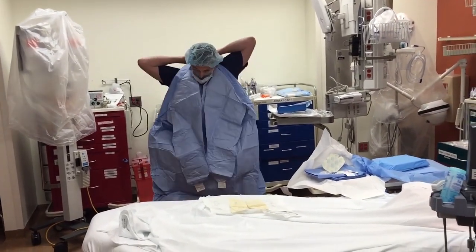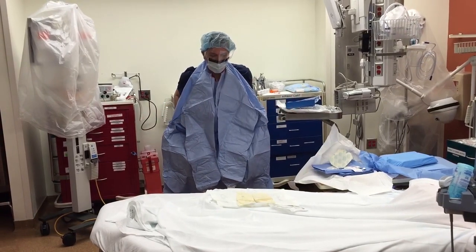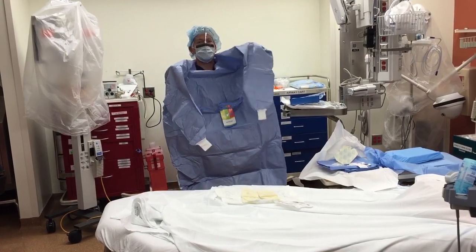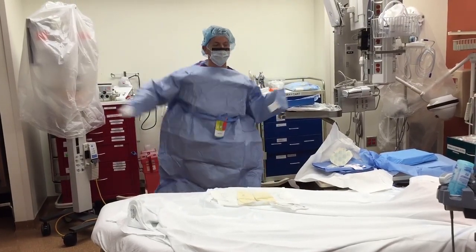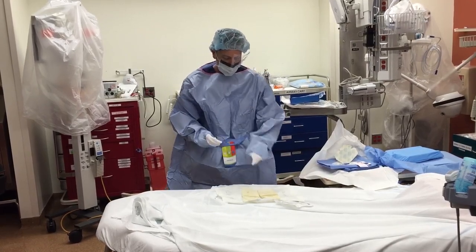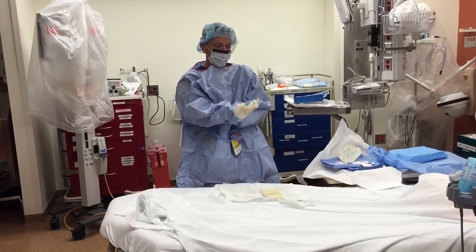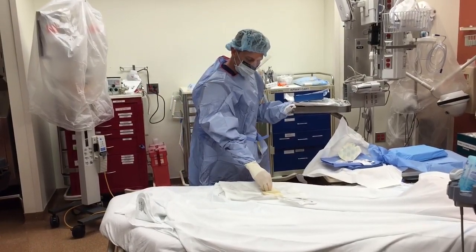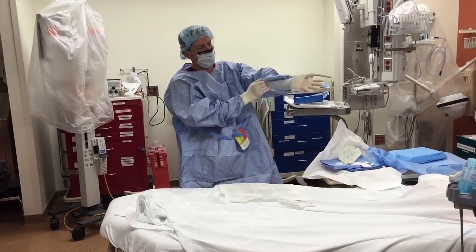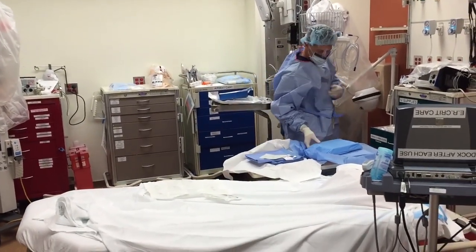Grab the Velcro and put it behind your neck. And I should say that you previously washed your hands before starting any of this, as you guys all know. Your hands go into the sleeves but they don't pop out, and now you can put on your gloves without your hands ever emerging until they're actually inside your gloves.